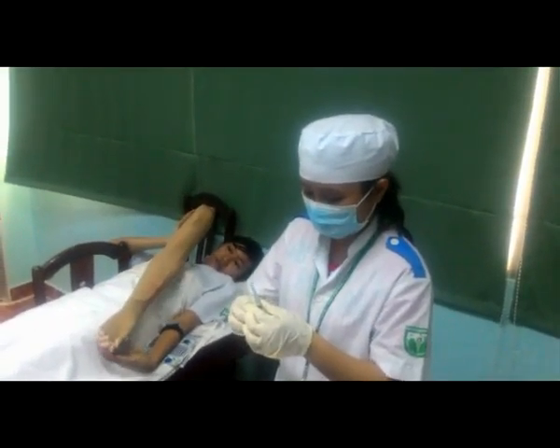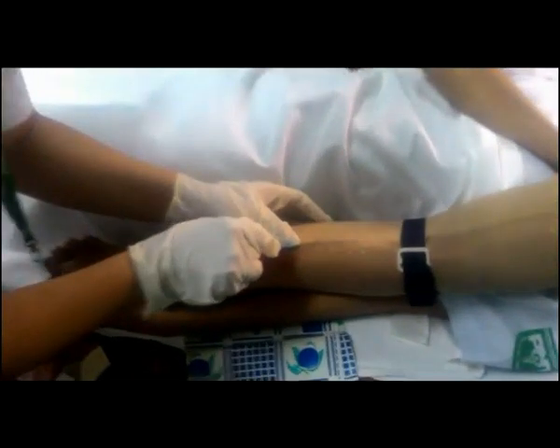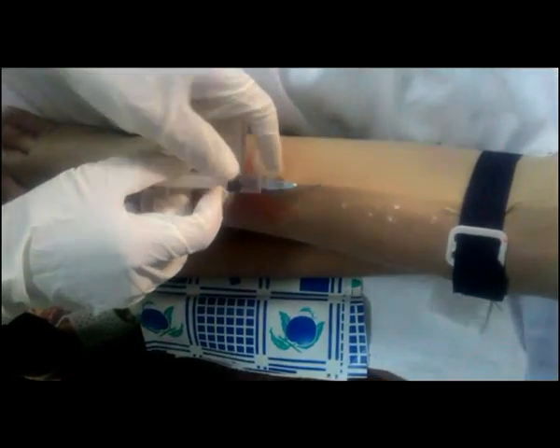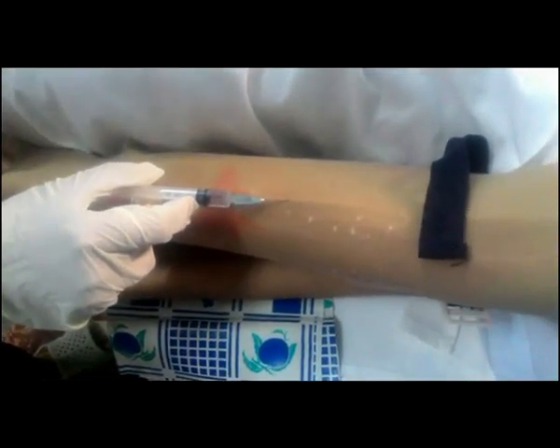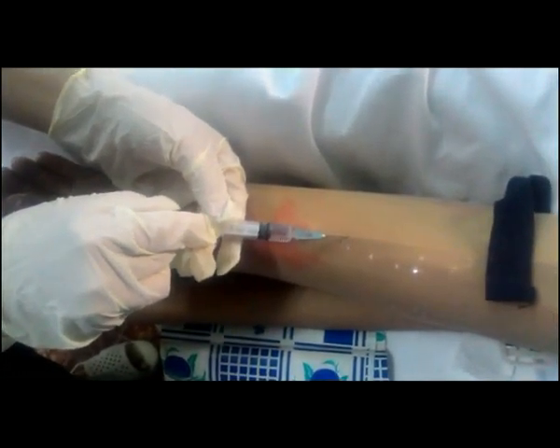Kiểm tra bóng khí lần cuối. Mở nắp kim, ngón cái tay không thuận mít căng da dưới tĩnh mạch. Tay thuận đâm kim một góc 15-30 độ qua khỏi mặt vát kim, sau đó hạ kim song song da. Luồn kim vào 2/3 hoặc 1/2, rút nòng, kiểm tra có máu là đúng.